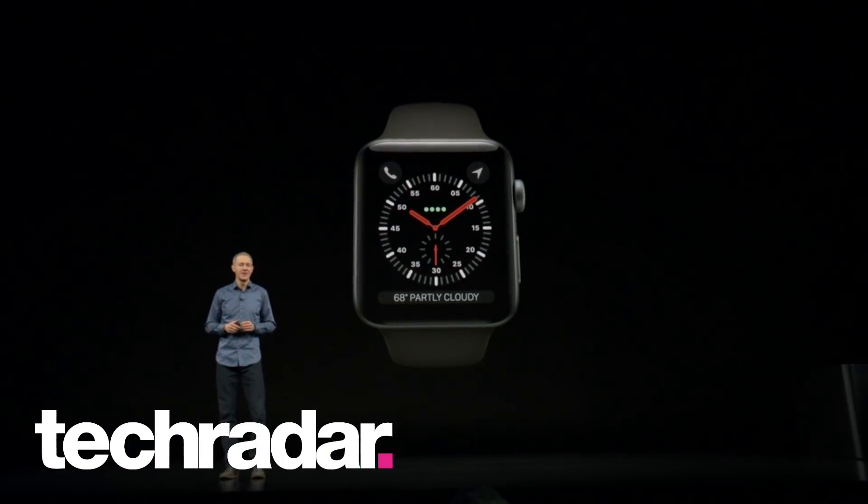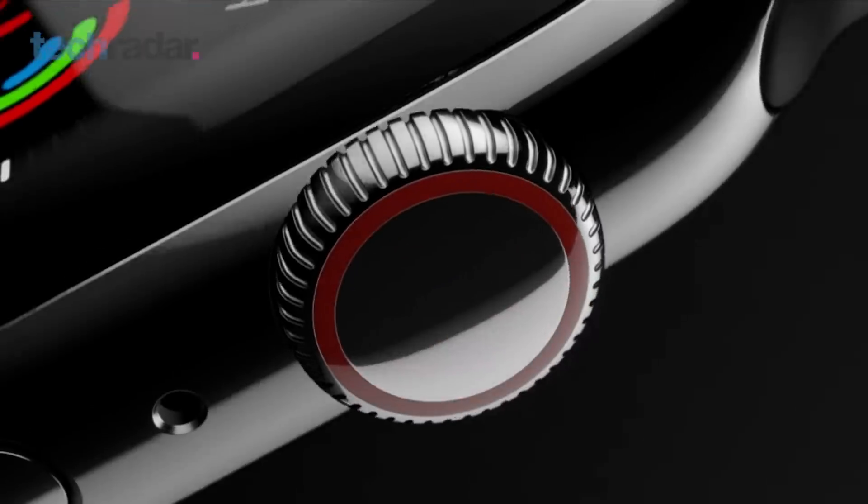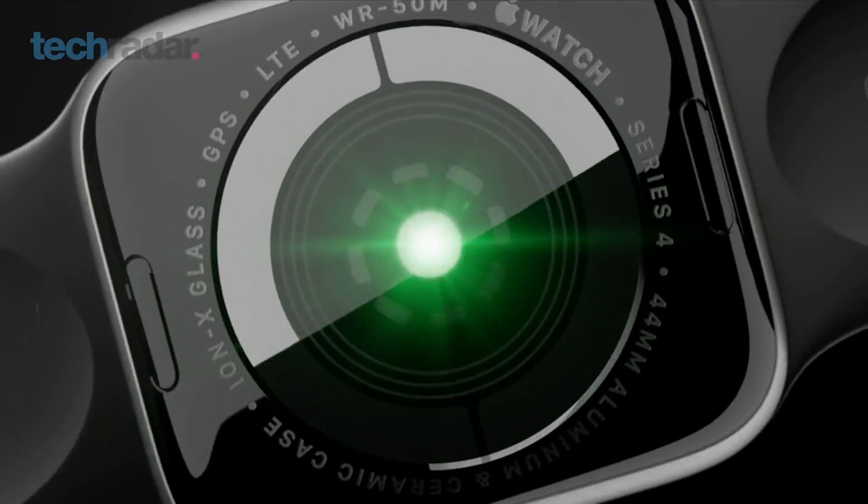The new Apple Watch Series 4 is here. It's got a bigger display — 30% larger than its predecessor — with smaller bezels, and this thing can even take ECGs.